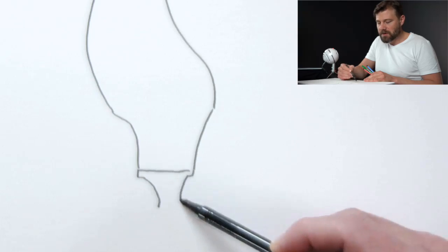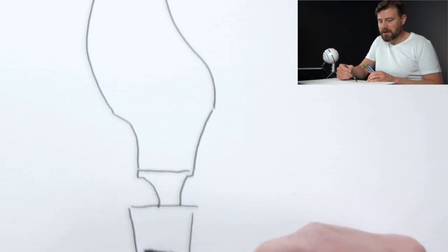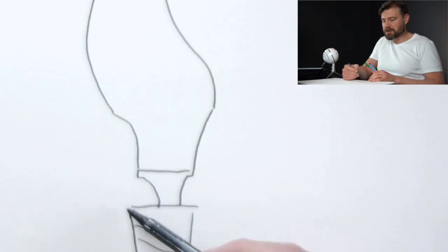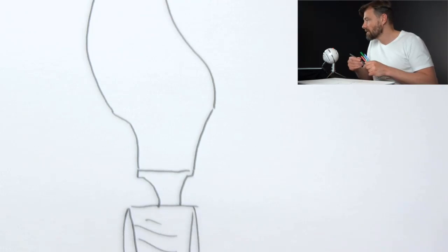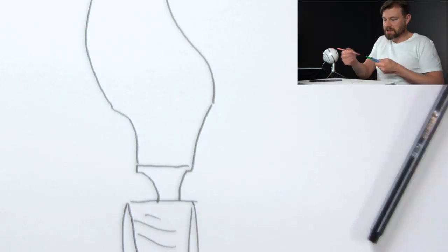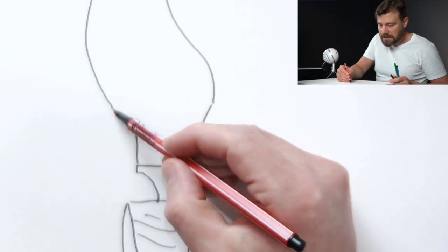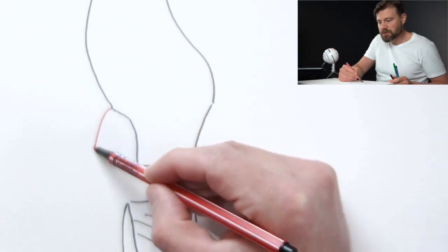This is a stock abutment, so let's design also the implant here, and let's pay attention to our soft tissue. That is the most important part for us to take care of, okay? So here usually is my soft tissue contour.